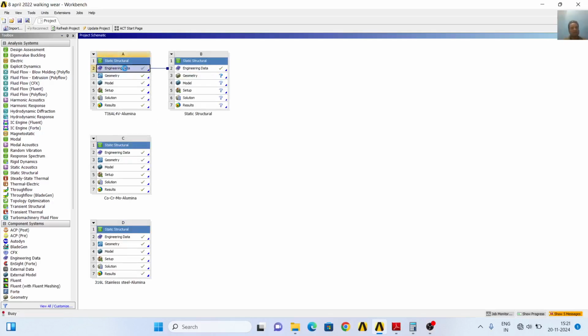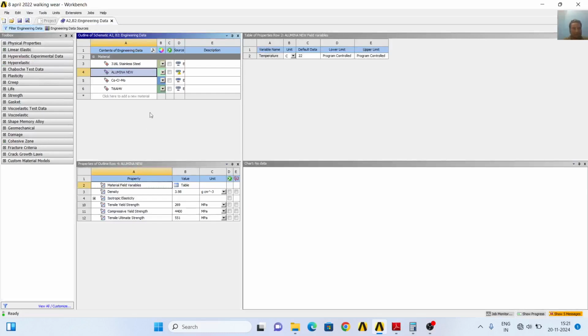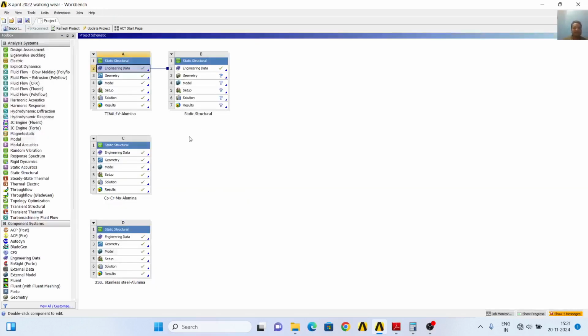In engineering data I have already given the properties of stainless steel. You can see here all these properties: alumina, cobalt chromium, and titanium. So there are four materials which I have already predefined for my analysis, and these materials will be used in our analysis. I will close here, and I will also copy this geometry here, and now I will go to model.